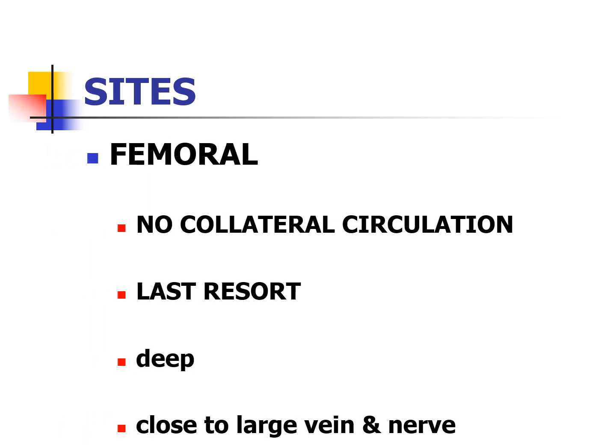The femoral location, like I said, this is the best site for code. It's your last resort site. So there is no collateral circulation. So if something were to happen and you lacerate the femoral artery, there will be no blood flow to the whole lower part of the leg. So no part to the thigh or the lower part of the leg, of course. So they would, in theory, lose their whole leg.